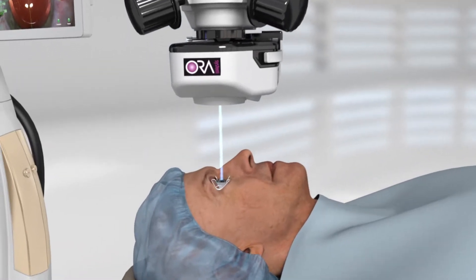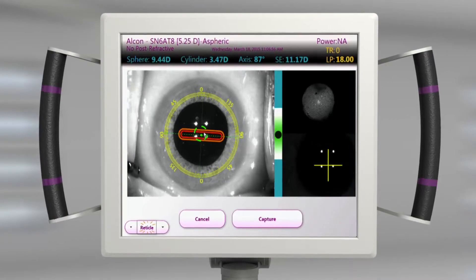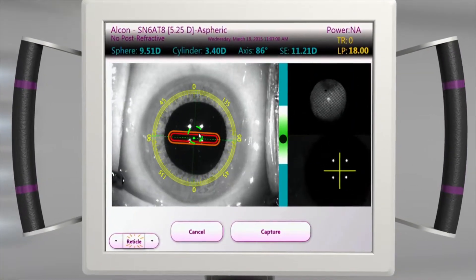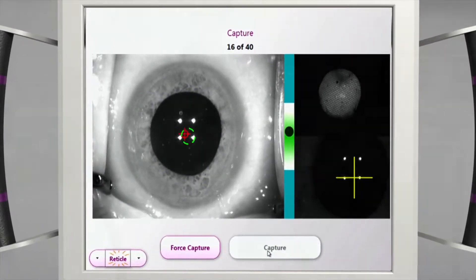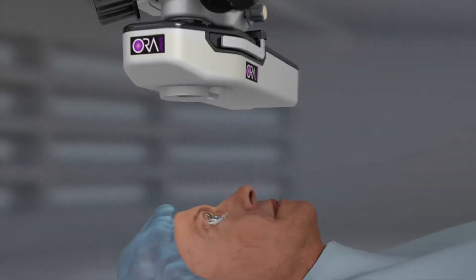During a cataract procedure, the ORA System with VerifEye+ technology provides real-time data verification in the OR that allows the surgeon to validate and refine his or her surgical plan as needed. This provides continuous assessment of the patient's eye, allowing for highly accurate refractive measurements.